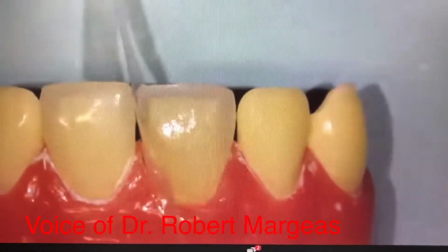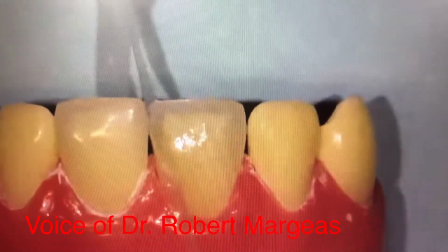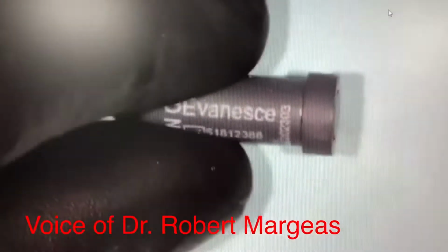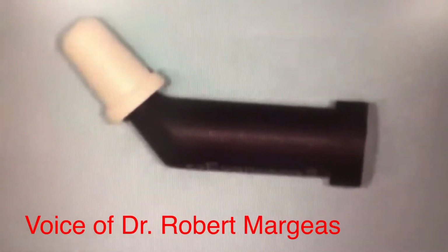And so what I like to do is this. I like to take my gloves and clean them with alcohol, like this. Clean with alcohol, because what I'm going to do now is take a material called enamel clear, ENC. This is a clear material because I want it just to occupy the space. All we're doing is occupying the space. And what I do is this. I'm going to take just a little piece off first again.